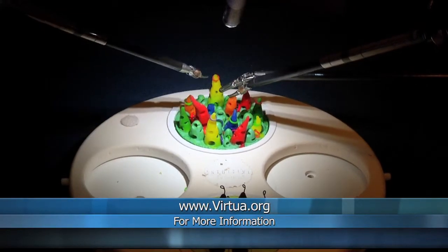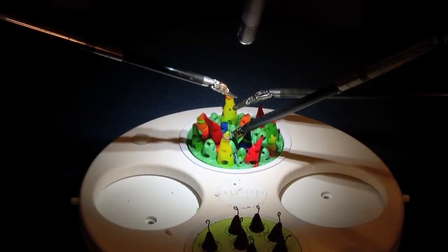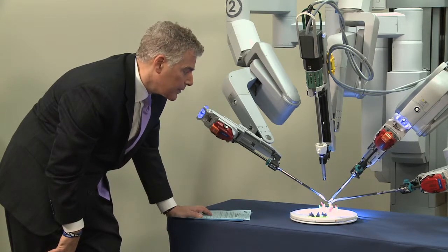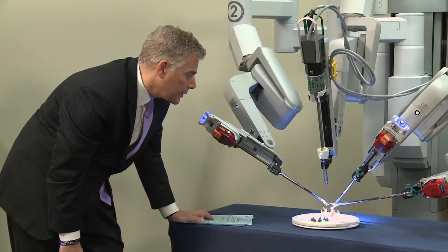It takes the shake out of the hand? The tremor, yeah. There's an inherent tremor which surgeons tend to have sometimes. As you can see, I'm absolutely... You're doing that on purpose? I'm doing that on purpose, right. But you can see here, as I'm holding this right now, you don't see any shake at all. Because? That's just the way the technology has been designed.